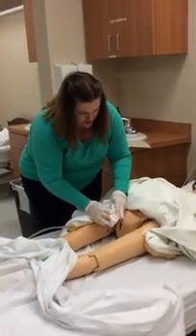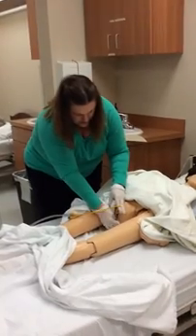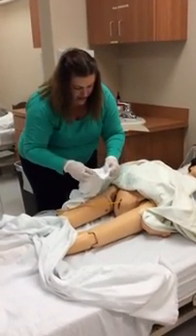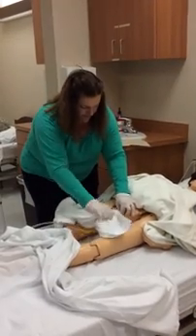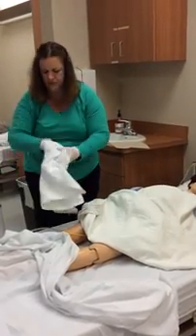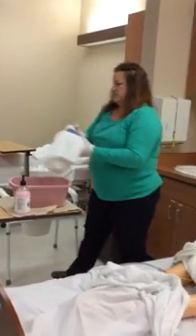Just if you need to, you can hold the catheter up so that you can go down the center, down the perineum. And you still have to clean or dry the catheter. Cover my patient. I'm going to get rid of my linens now so I don't have to leave them on a tabletop. There's my laundry basket. Pretend right there.